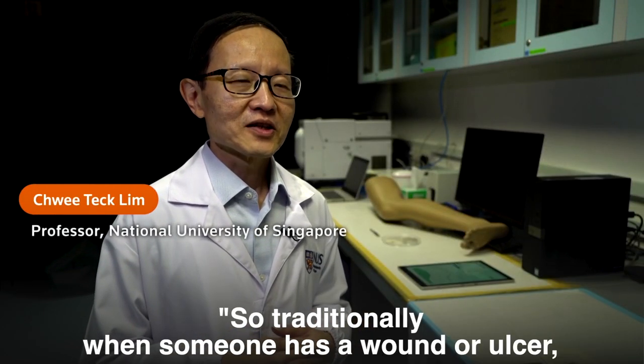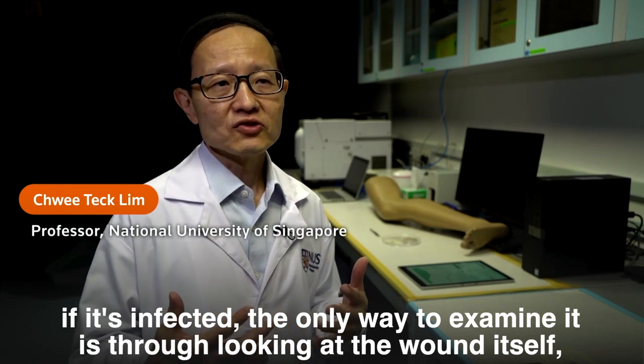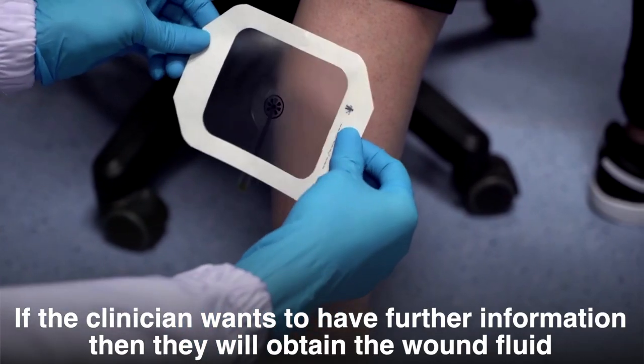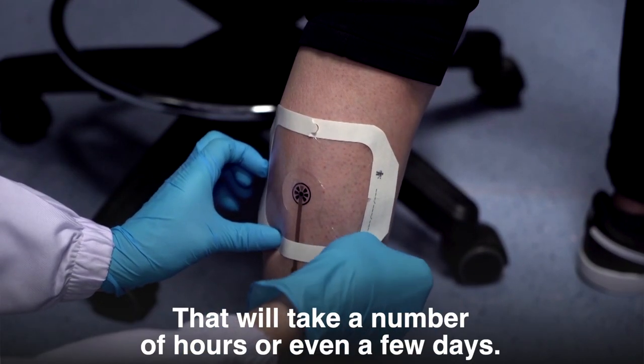Traditionally, when someone has a wound or ulcer and it's infected, the only way to examine it is through visual inspection. If the clinician wants further information, they obtain the wound fluid and send it to the lab for further testing, which takes a number of hours or even a few days.